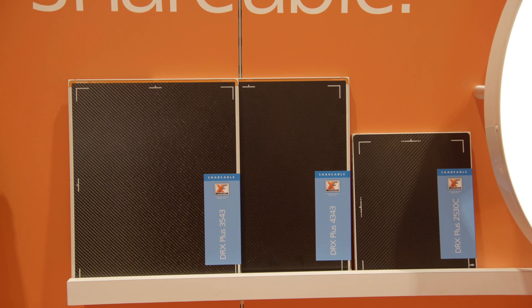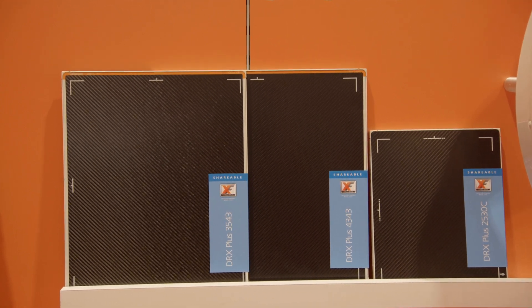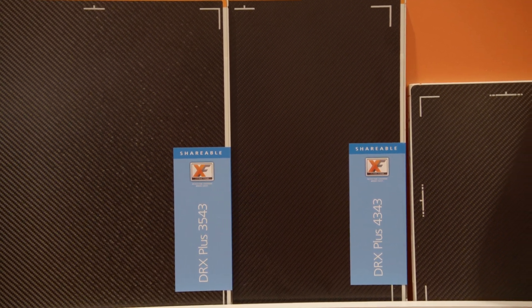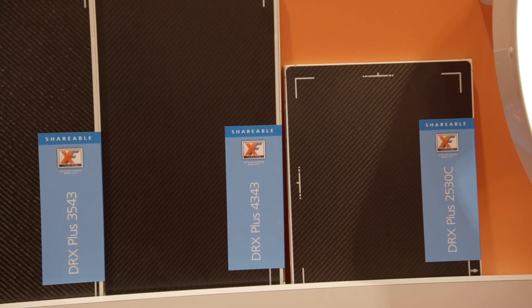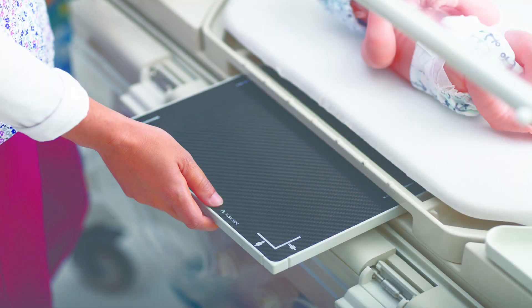The DRX Plus detectors come in various sizes. The 35x43 is wireless and great for in-bucky or tabletop exams. The 43x43 works well for fixed bucky exams and has a larger imaging area that makes it well-suited to image bariatric patients. The DRX Plus 2530C is our small format detector, ideal for extremity exams and pediatric imaging, as it fits nicely into bassinet trays.